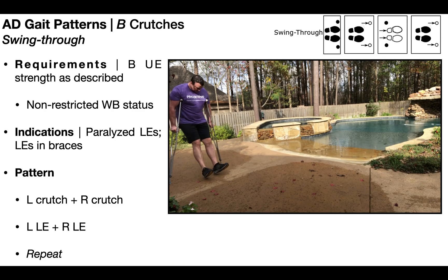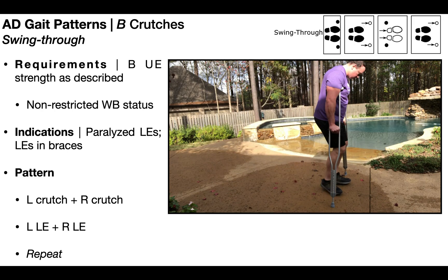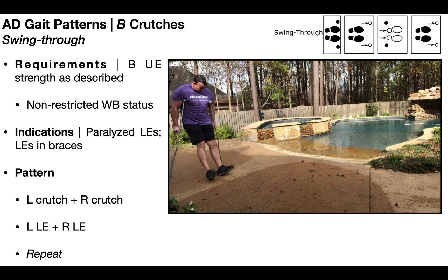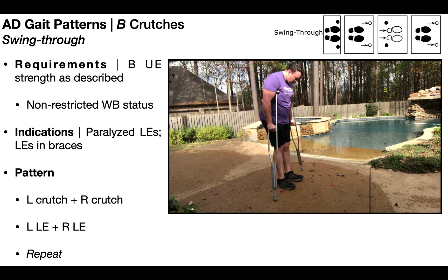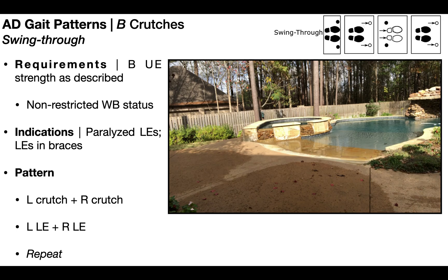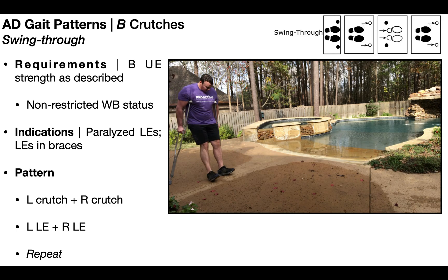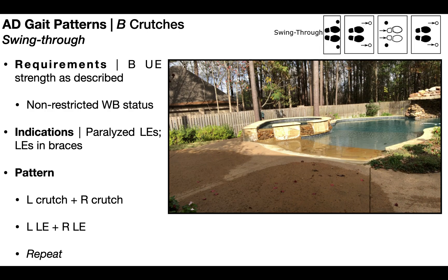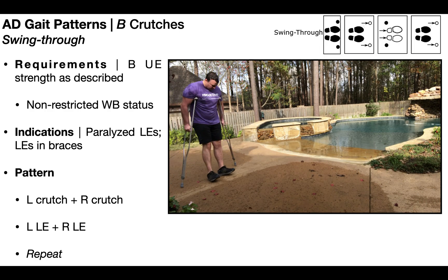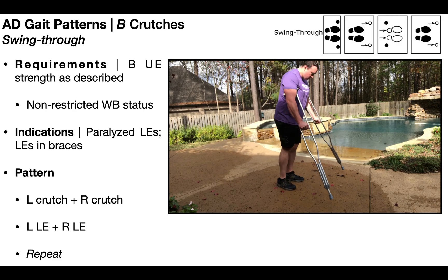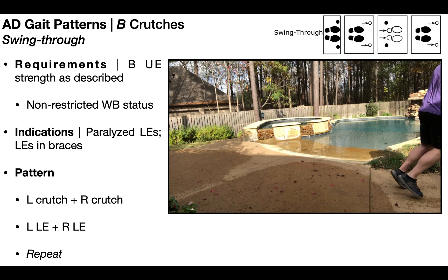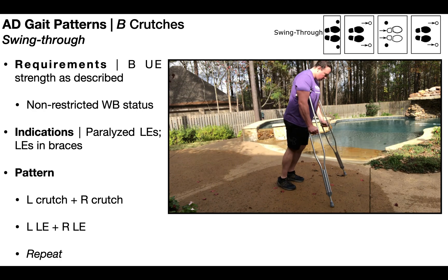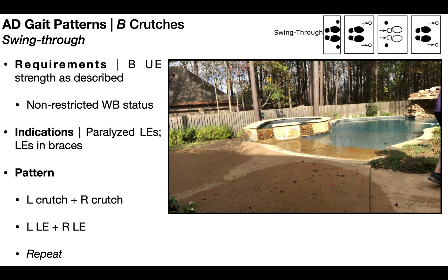Now let's take a look at the swing-through gait pattern. This has the same requirements and indications as the swing-to pattern and is almost identical in how it works. First, I'm advancing both crutches or assistive devices at the same time, and then advancing both legs at the same time. The major difference compared to the swing-to pattern is that now the legs are advancing beyond the point of the assistive devices — swinging through them — which is what gives this pattern its name.